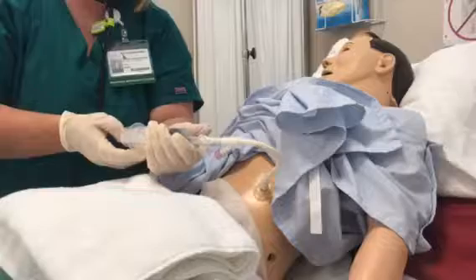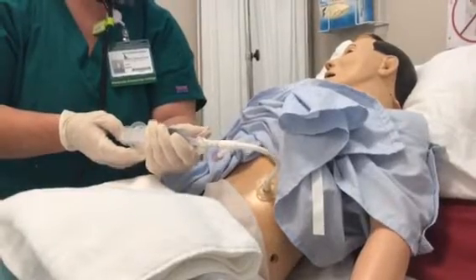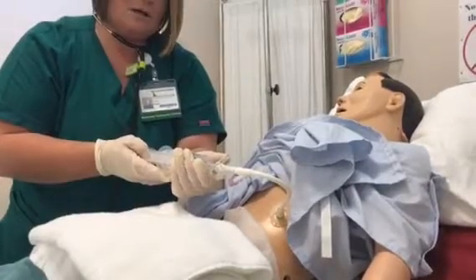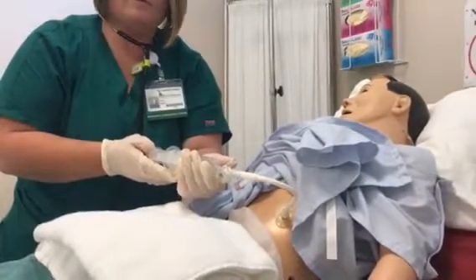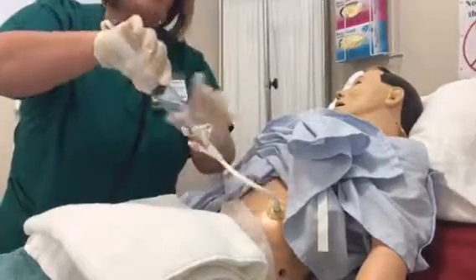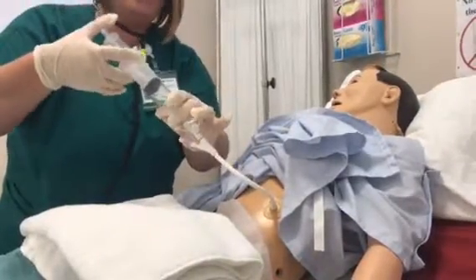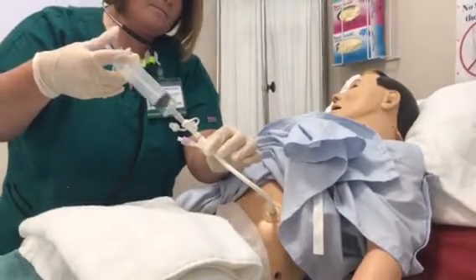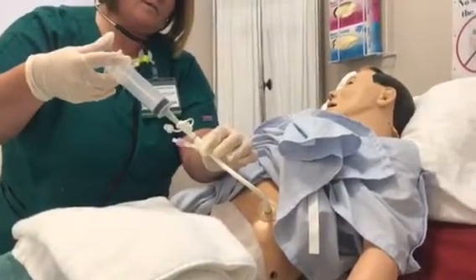And while you're pulling back the residual, you want to make note of the appearance of the residual as well as the amount. And it looks like we're meeting resistance at 40 mLs. So, because it's less than 200, I'm going to go ahead and push all but 1 ml back in. I need to check the pH with that 1 ml.